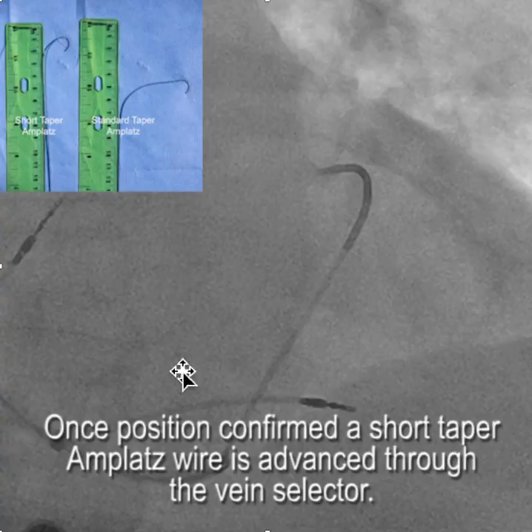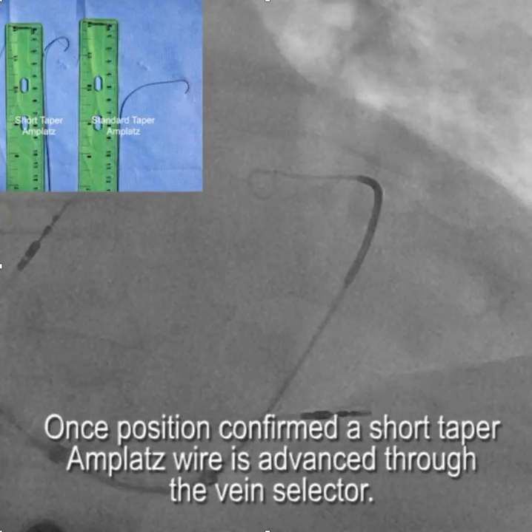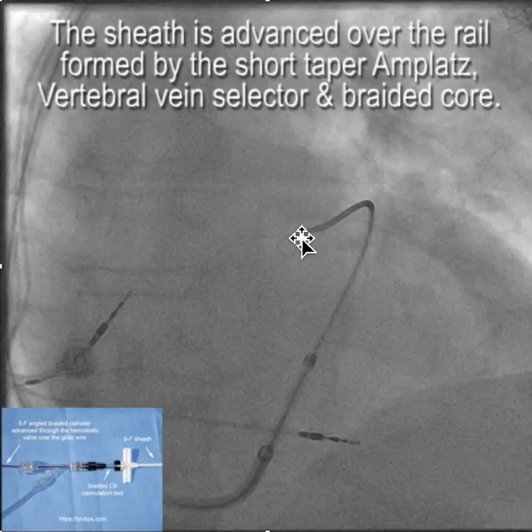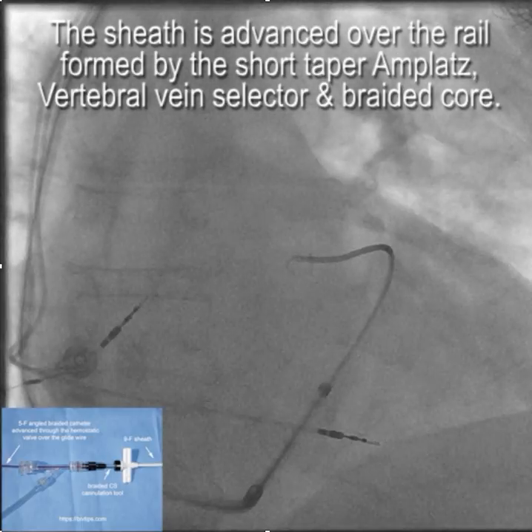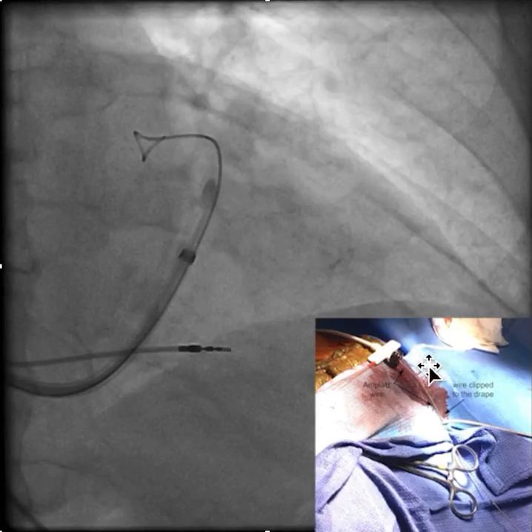Once we get the vein selector positioned safely up by the anterior interventricular vein, we advance a short taper Amplatz wire through the vein selector — remember the importance of the short taper Amplatz wire, as discussed before. Now we've created a rail: here's the short taper Amplatz wire, here's the vein selector, here's the braided core, here's the sheath. We're advancing the sheath over the braided core vein selector rail up into the coronary sinus. Once everything is deep in the coronary sinus with the Amplatz wire in position, we clip the Amplatz wire to the drape.